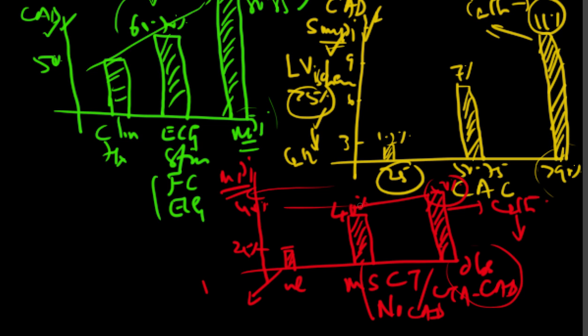So what have we learned? The take-home message is very clear that you have half the cases of obstructive CAD pattern based on a multi-slice CTA still requiring cardiac cath only after myocardial perfusion imaging. Very important. And yet patients who have non-obstructive CAD and normal looking multi-slice CT studies, they are almost 50%, 10, 15, and 40% here. So about 50% of these cases will also require a myocardial perfusion imaging before a cardiac cath is planned. And only about 40 to 45% of these patients will eventually go for angiogram.